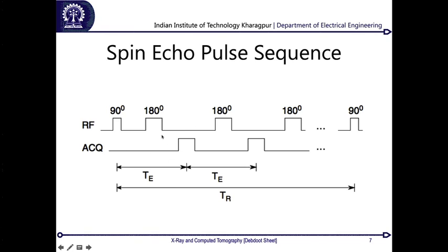Now as we keep on doing it, we will see that initially there is an excitation time in which first I will have a few of my protons in a high energy state and a lot of them in a lower energy state. So after giving this first excitation, I basically turn all of my low energy states into a neutral state, okay. Next I give some more energy such that all of them bend and go to a high energy state, and then I leave it.